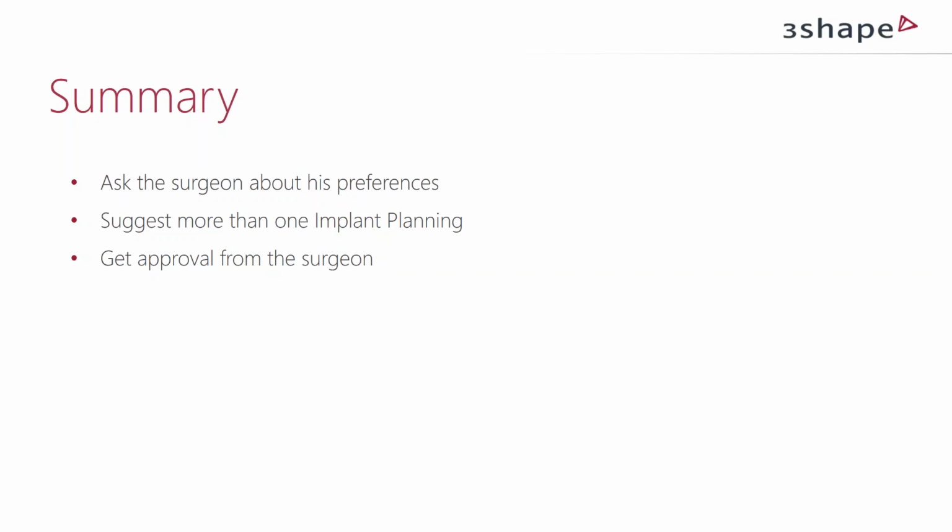Then there's a question on CBCT files and 3Shape Communicate, if that can be transferred via Communicate, just like a Trios scan. And here the short answer is right now it cannot. It will not go through.